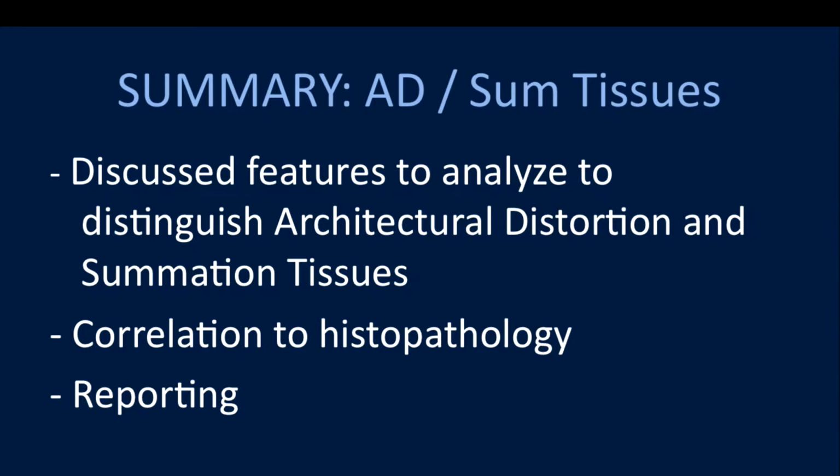So first I'm going to chicken out a little bit and say, obviously you should do your own audit. That's a way to get out of here. When I'm doing my biopsy, I will also look to see where the clip is, and I will get really well compressed, not undercompressed, tomo views in both projections to see if the clip is actually in the center of it. And then what you're asking, and maybe the elephant in the room, is will I follow distortion that's benign that I think that I hit?